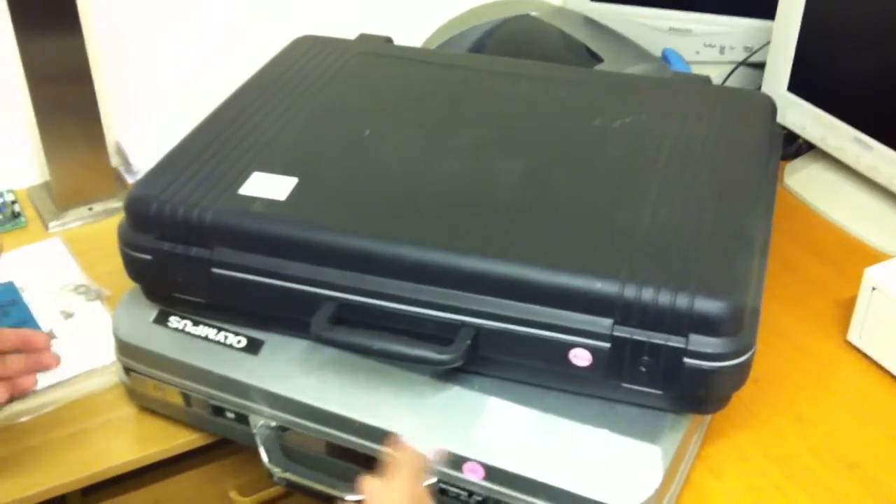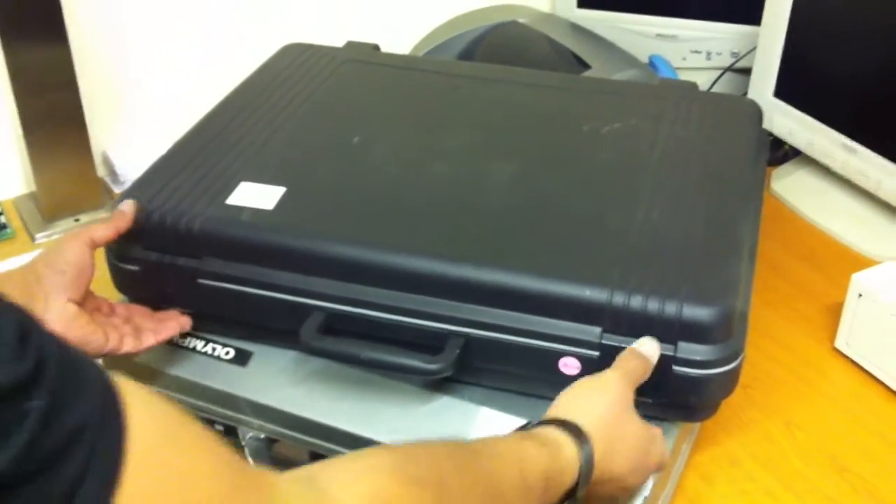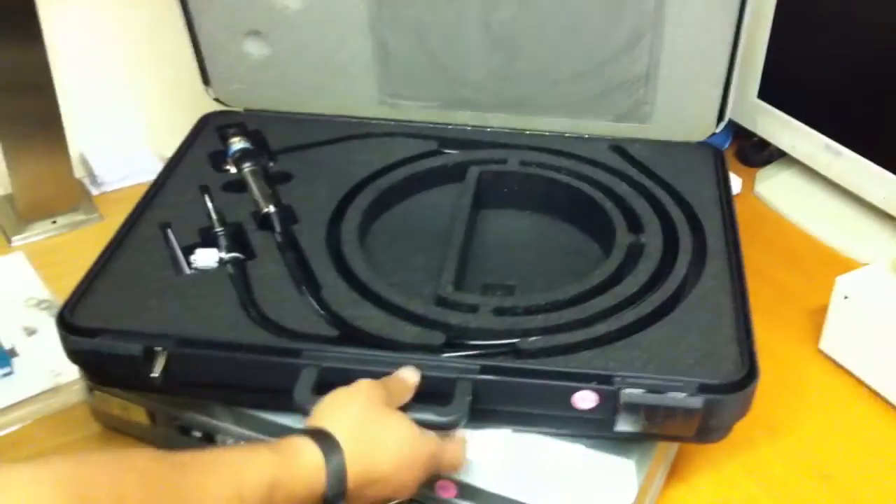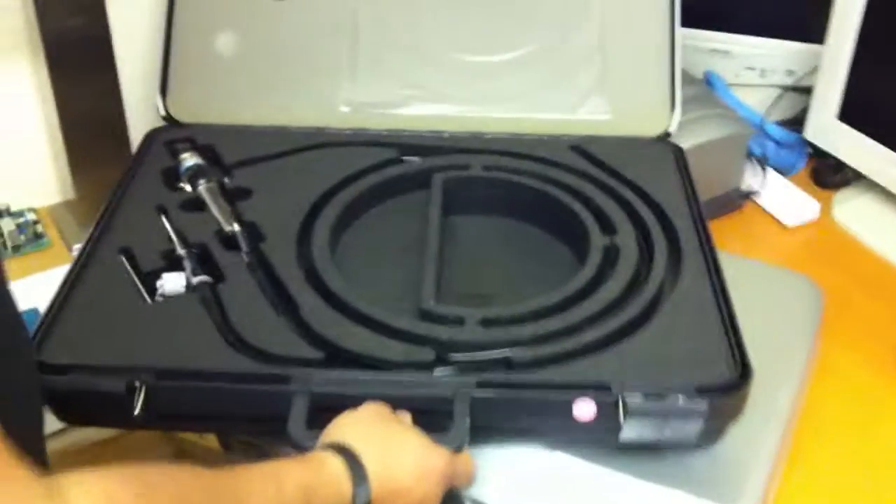As I was saying earlier, a lot of the endoscopes are in cases like this. This is for the Fujinon system I showed you earlier on. Completing a case, to give you an idea what they look like.